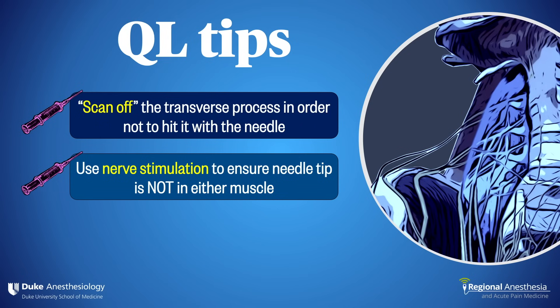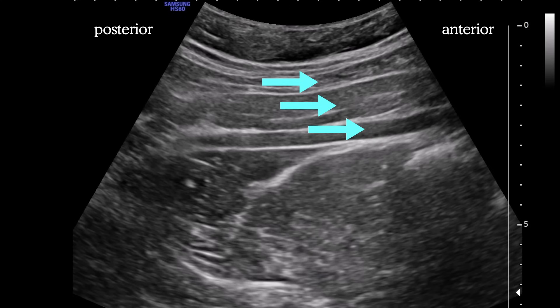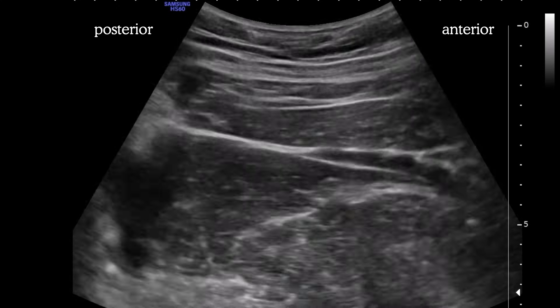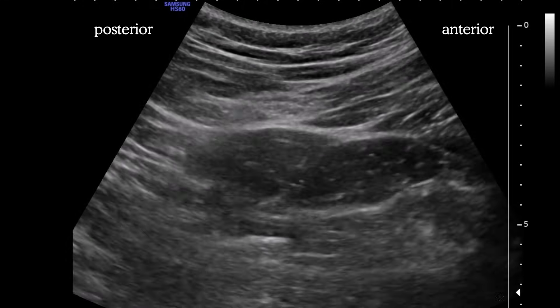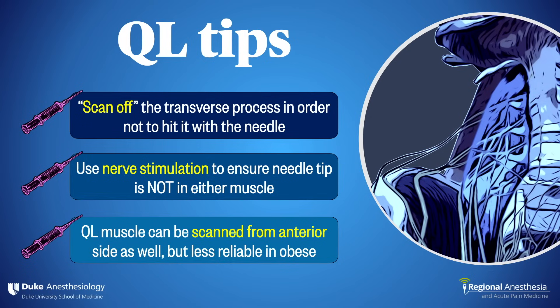Lastly, you can identify the QL muscle by scanning from the anterior aspect. Here we see the TAP muscles coming to an end, and the QL muscle lying deep to the internal oblique muscle. This strategy is better suited to finding the QL muscle for the lateral and posterior approaches, as the plane between the QL and psoas doesn't light up quite as nicely. Especially in challenging patients, relying on bony sonographic landmarks is a reliable path to success.